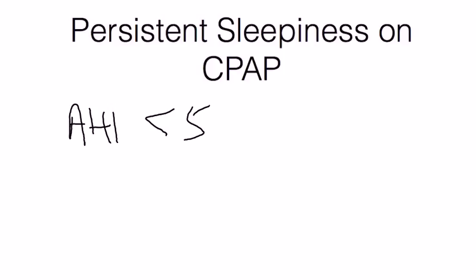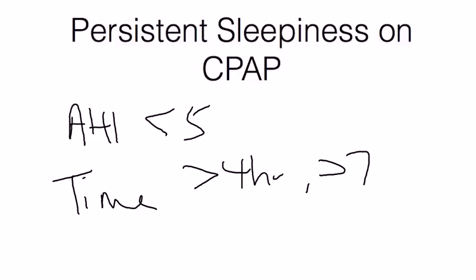The other issue is time. Now, usually most patients will attest to the fact that they're using the CPAP machine appropriately. However, when looking at the download information, you'll find that many patients are underutilizing it. It's important to use it at least 4 hours a day and at least 70% of the time, which is an insurance requirement, and most of the initial basic CPAP studies were done using this criteria. However, it's important that the patients use it as long as possible and as often as possible.